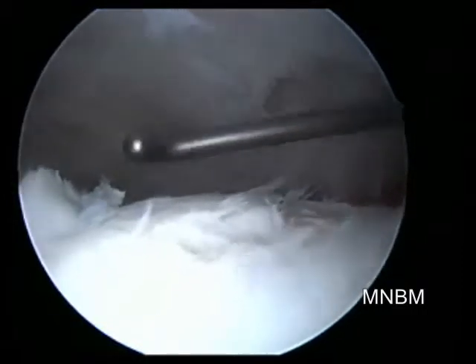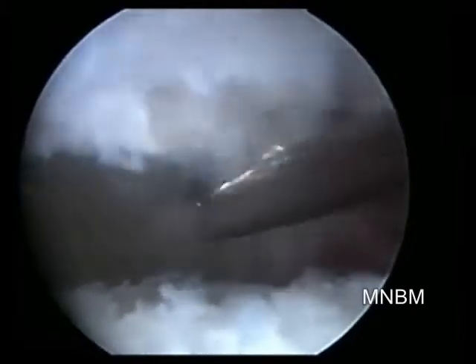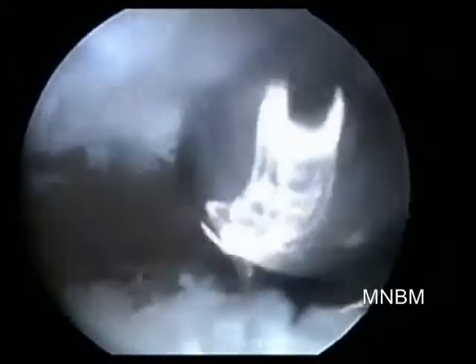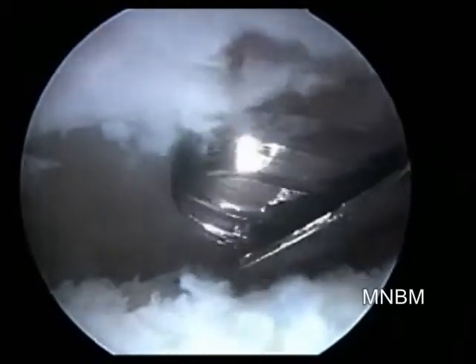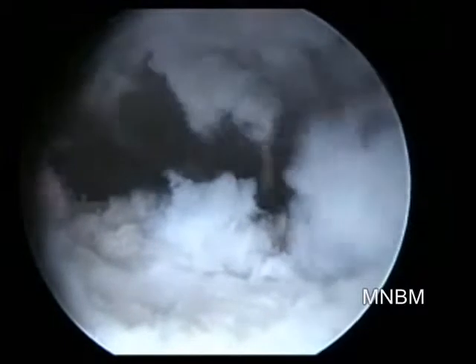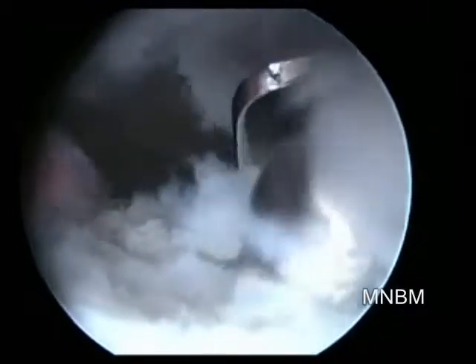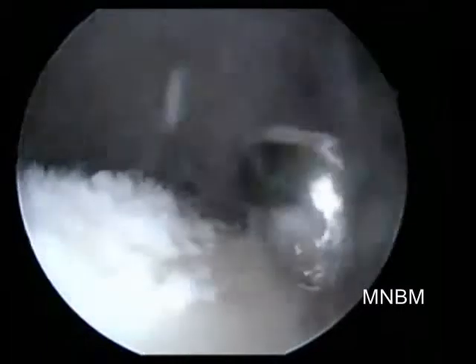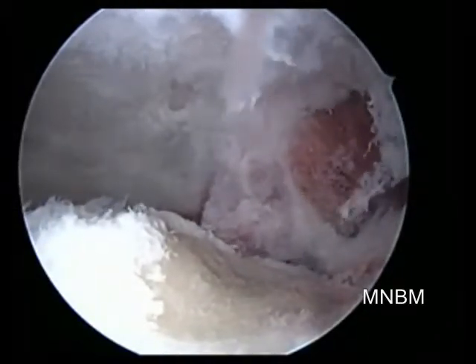These are precursors to osteoarthritis of the hip. The second instrument which comes in is the burr, which takes off loose pieces of cartilage from the femoral head and from the acetabular labrum, along with debriding the osteophytes in the superior portion of the femoral head.